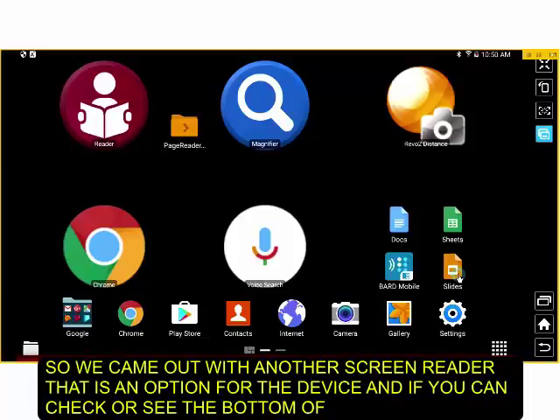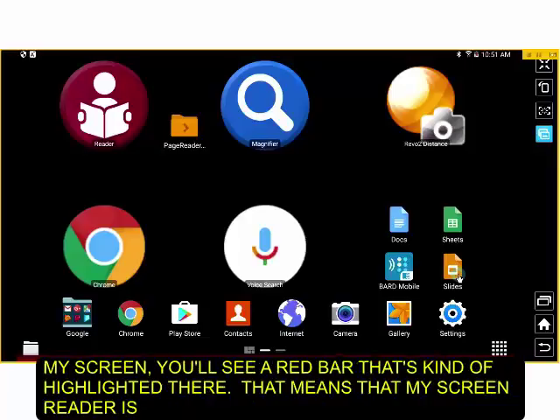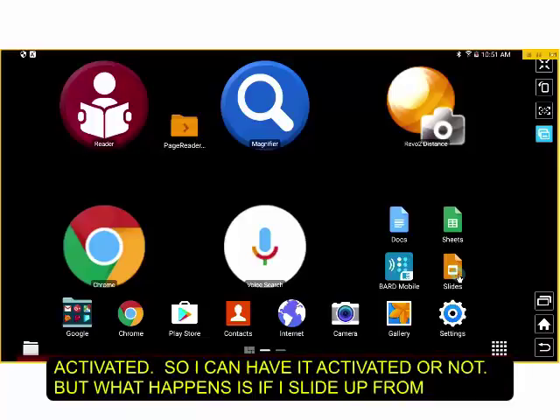So we came out with another screen reader that is an option for the device. And if you can check or see the bottom of my screen, you'll see a red bar that's highlighted there. That means that my screen reader is activated. So I can have it activated or not.